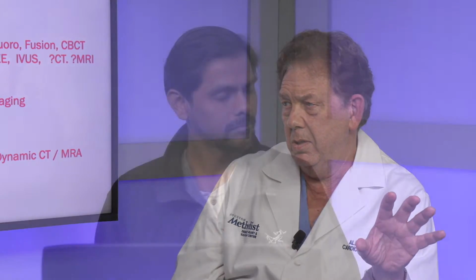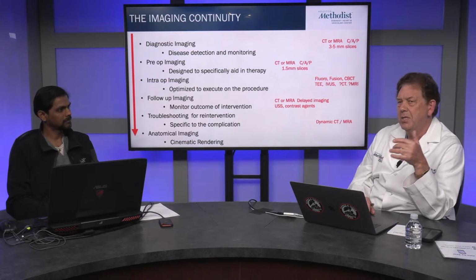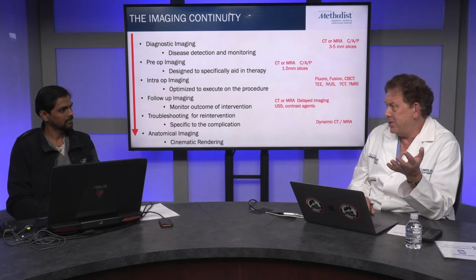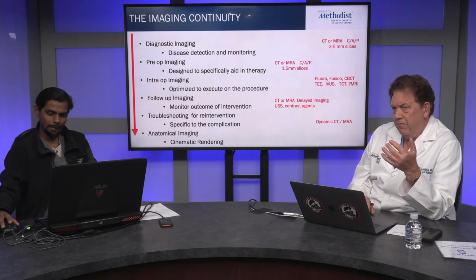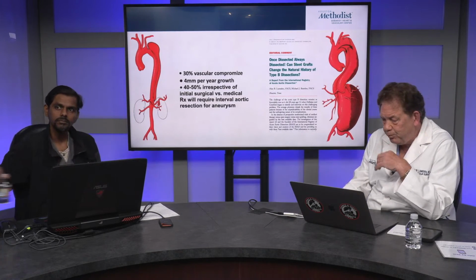And the CT scan is fundamentally important, for the folks from Medtronic who are watching this: he who owns the CAT scan owns the case. That's true of the surgeon, or the interventionalist, and it's true of the rep. The CT scan is very important in initial diagnosis, and then much more so, for example, if you've got a fenestrated graft, that CAT scan has been used to design the entire graft. So it's fundamentally important that it's of high quality, and then we use it for image fusion.